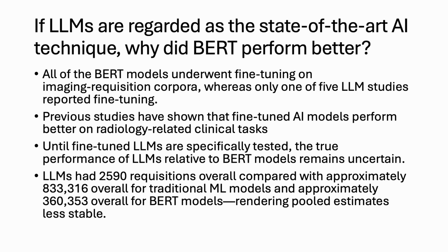So this begs the question, if LLMs are regarded as the state-of-the-art AI technique, why did the BERT models perform better in our analysis? And we opined that the likely reason for this is because all the BERT models in the analysis underwent fine-tuning, whereas only one of the 5 LLMs reported fine-tuning. And it's pretty well established in the literature that fine-tuning an AI model leads to better performance in radiology-related clinical tasks. And moving forward, until fine-tuned LLMs are specifically tested with enough of a sample size, their performance relative to BERT models still remains uncertain.